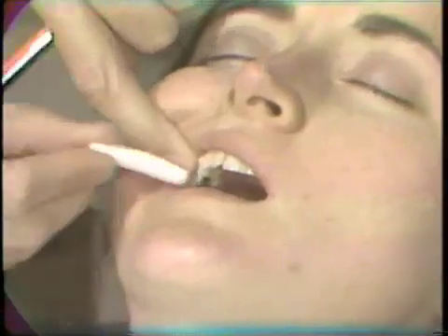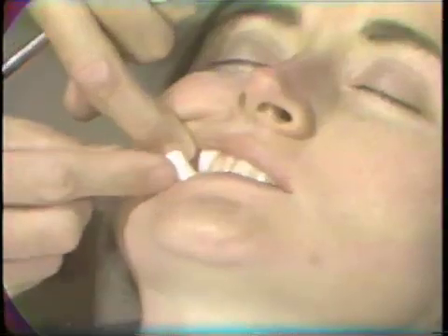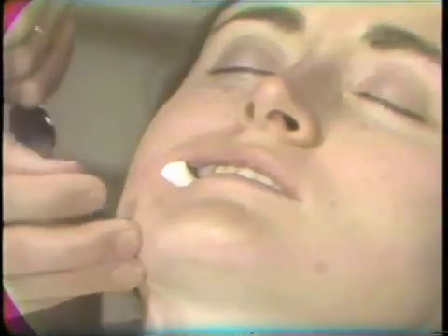This compression will now be altered. Removing the orange wood stick and placing a cotton roll. This cotton roll allows for a closer interocclusal dimension, with great pressure still maintained. This will be maintained until the cement has had adequate setting time of at least seven minutes.